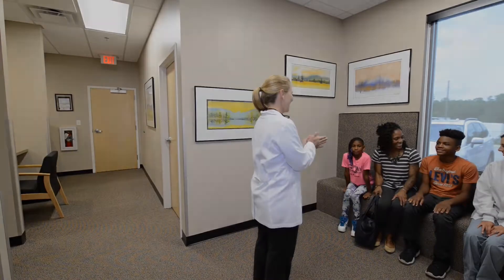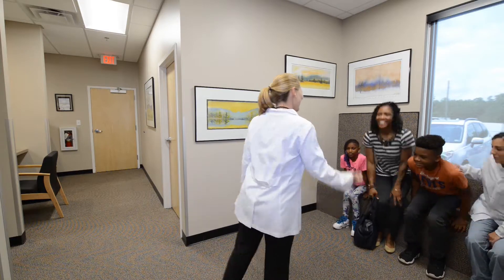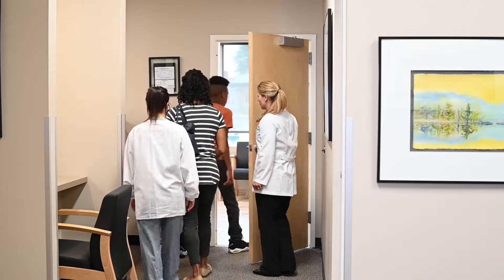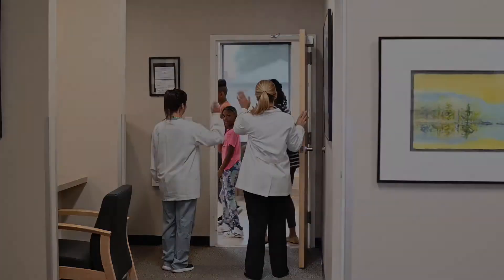Now is the parent's turn. Ask us any questions you may have about your child's braces. When all the questions are answered, we will schedule your child's first adjustment appointment. These adjustments occur about every two months at the start of treatment.